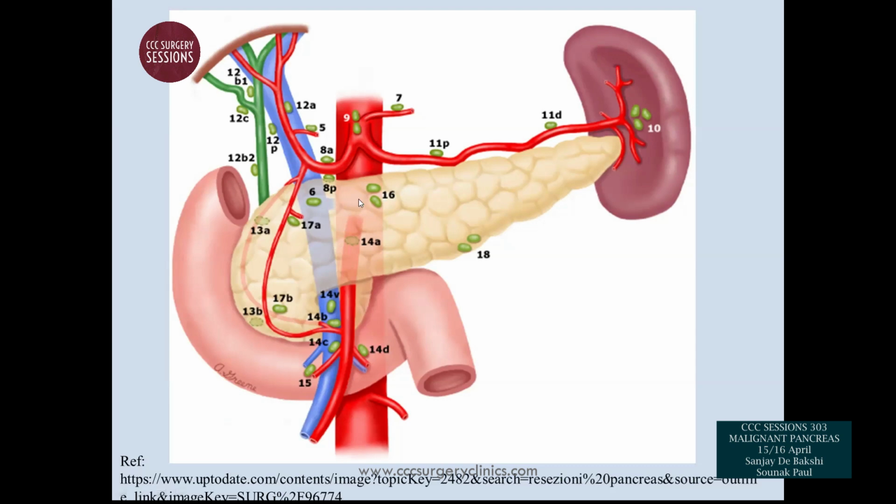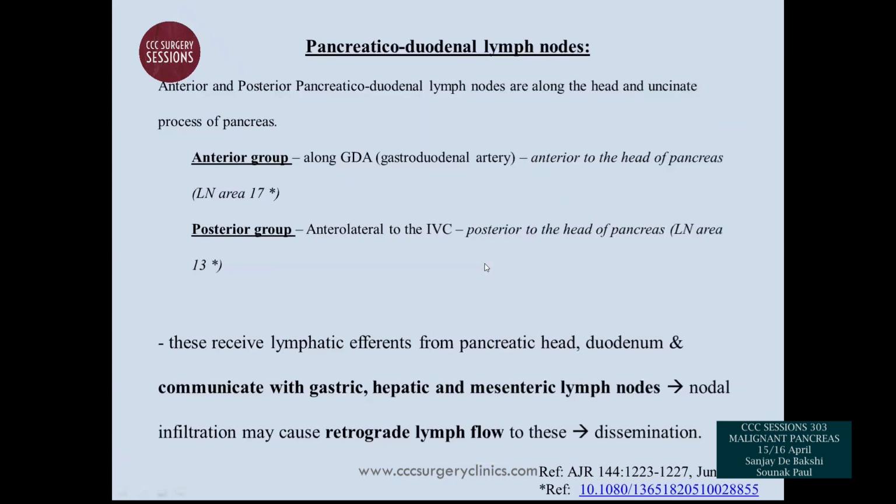All the nodes on the right-hand side of the aorta, the celiac and the superior mesenteric artery are regional, and they can come out in bulk. And anything on the left side of the aorta usually are metastatic lymph nodes. Sorry, I've been saying arteries for lymph nodes. Please pardon me.